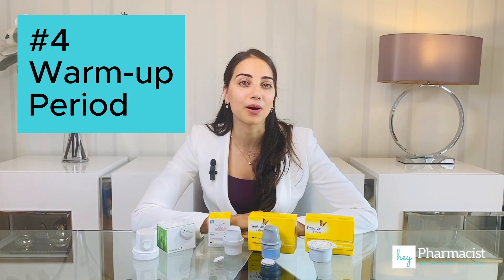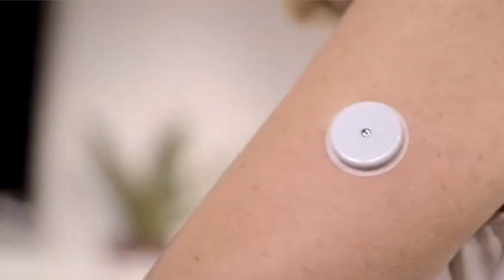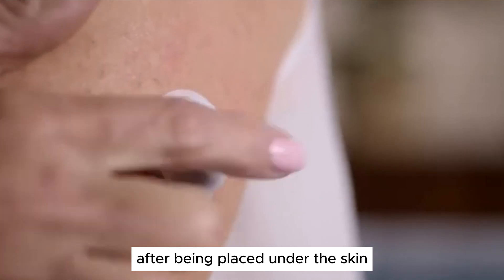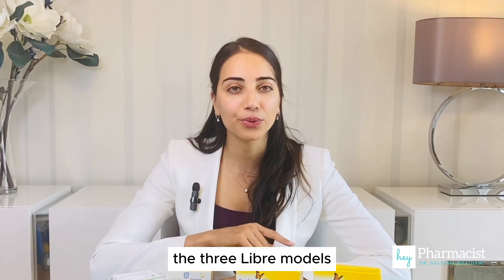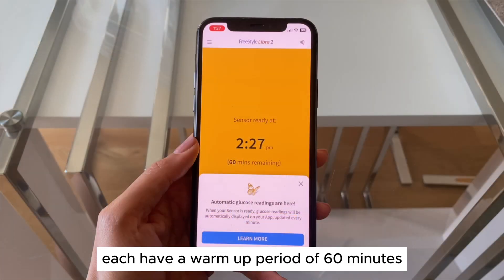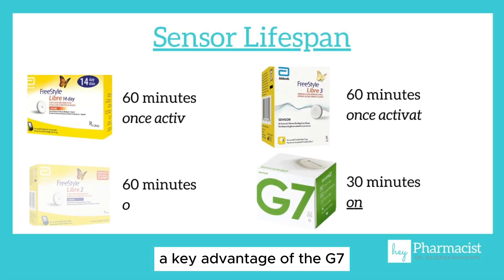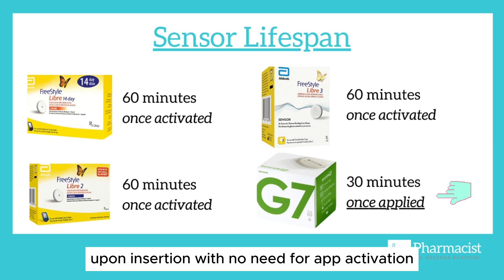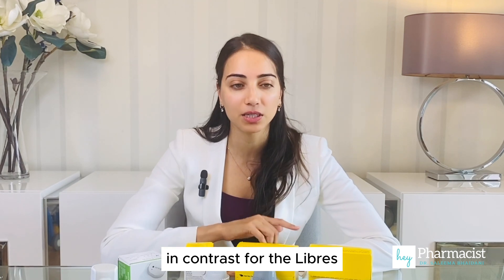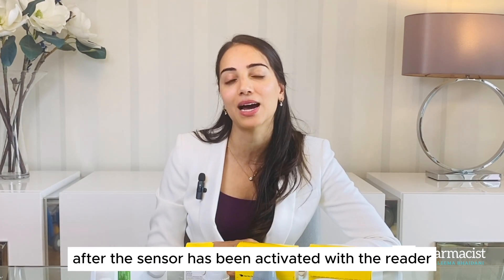Now let's talk about warm-up periods. All the devices need time to warm up, allowing the sensor to calibrate after being placed under the skin before glucose readings can be transmitted to the receiver. The three Libre models each have a warm-up period of 60 minutes, while the G7 has a shorter 30-minute warm-up period. A key advantage of the G7 is that its warm-up period starts immediately upon insertion with no need for app activation. In contrast, for the Libres, the 60-minute warm-up period only begins after the sensor has been activated with the reader.